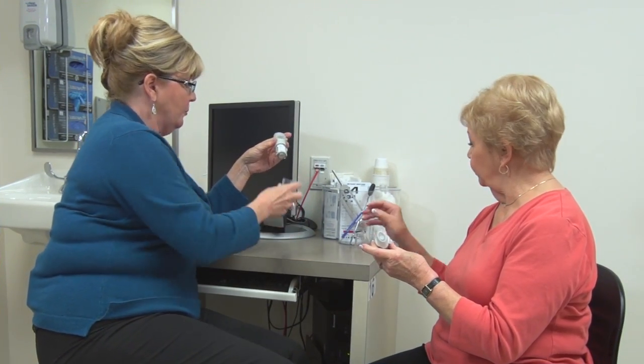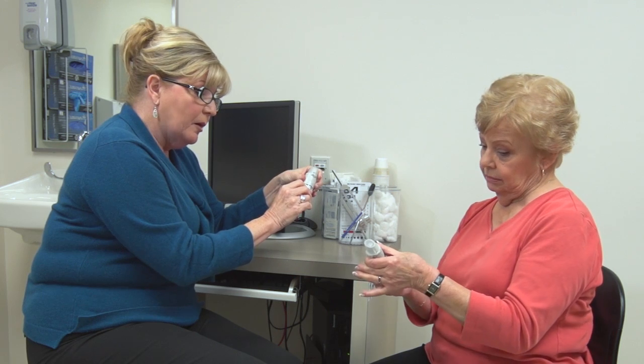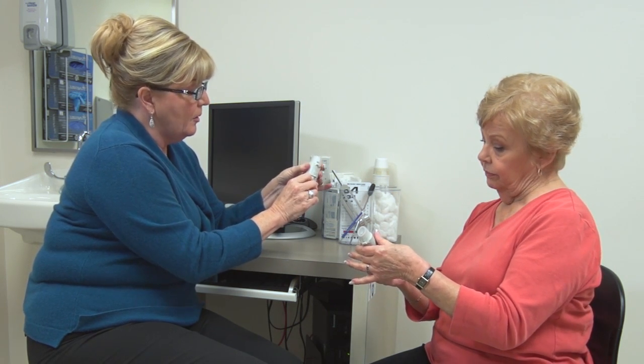Put the cover back on the same way, lining it up with the lever until you hear a click — that means it's back on. To begin priming, twist the bottom portion while holding the top, turning it about halfway until you hear a click. You can see arrows on the device indicating which direction to turn.